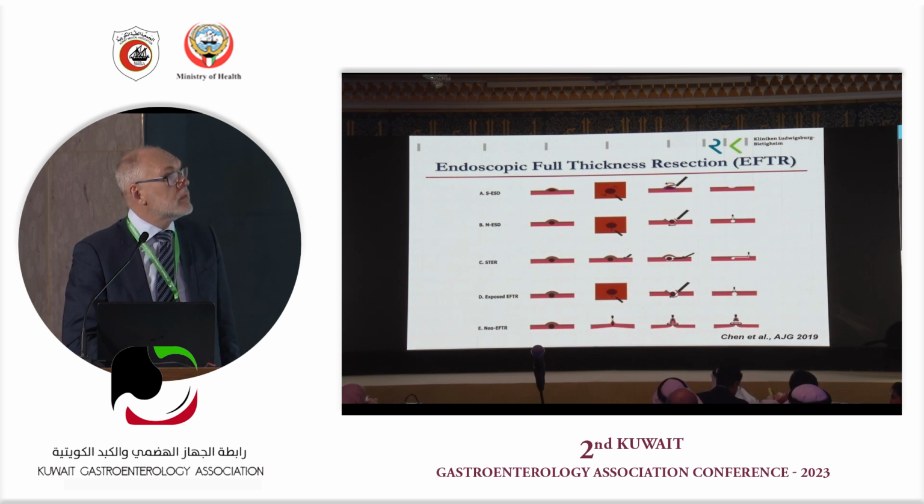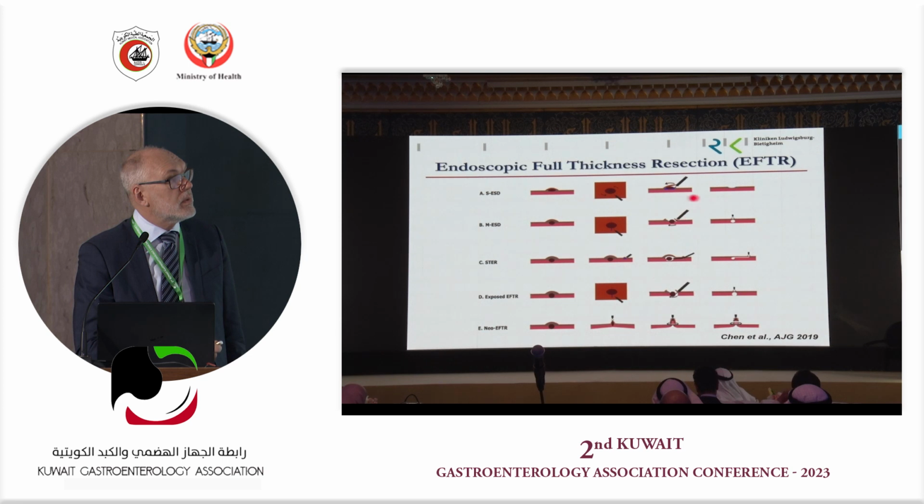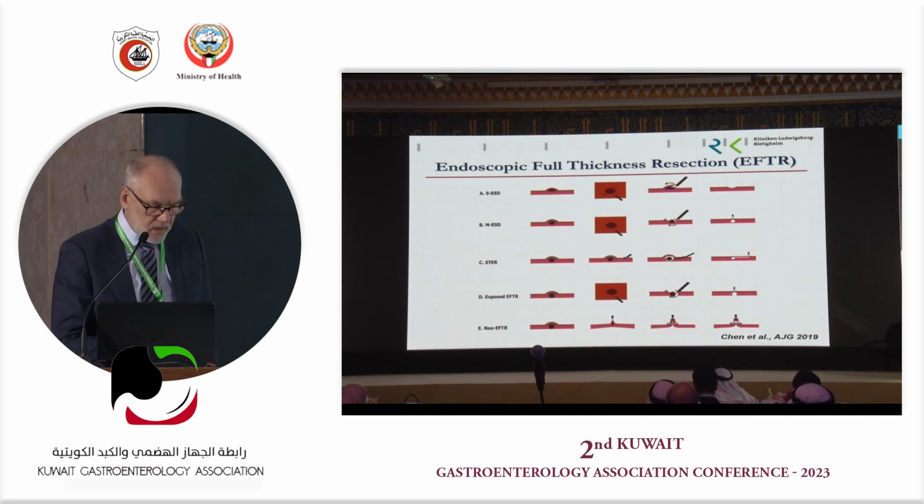Just briefly, with standard ESD, you're not opening the wall. With a modified ESD, you're going right through the adventitia. With the STER procedure, you are tunneling. With the exposed EFTR, you're making a hole and then stitching it up. And with non-exposed EFTR, you are making a wall duplication first and then cutting the lesion.